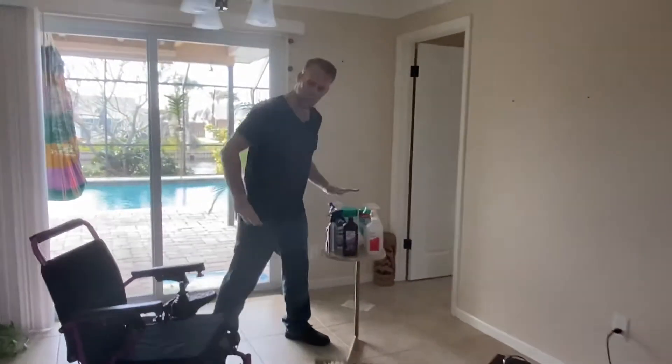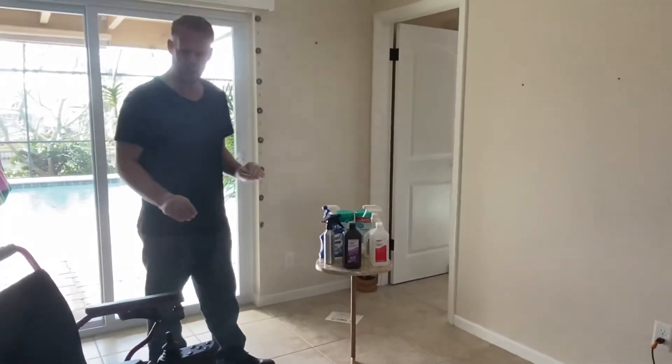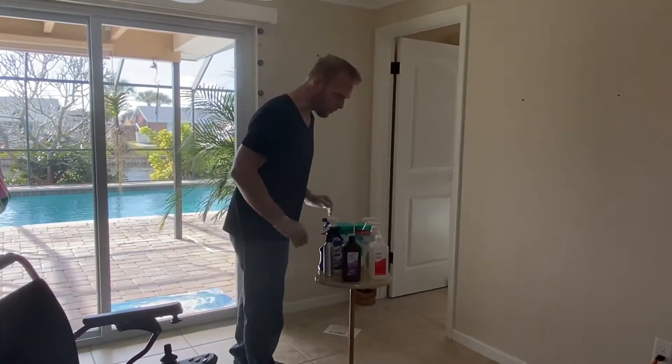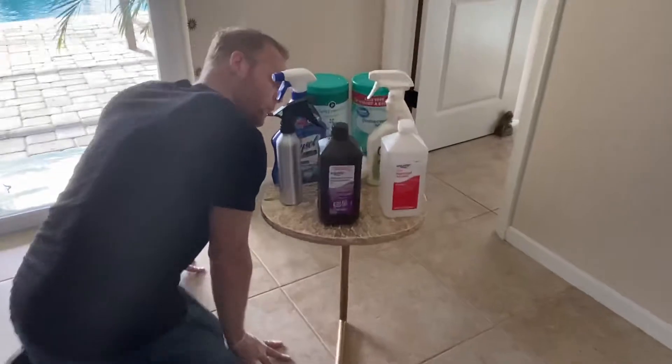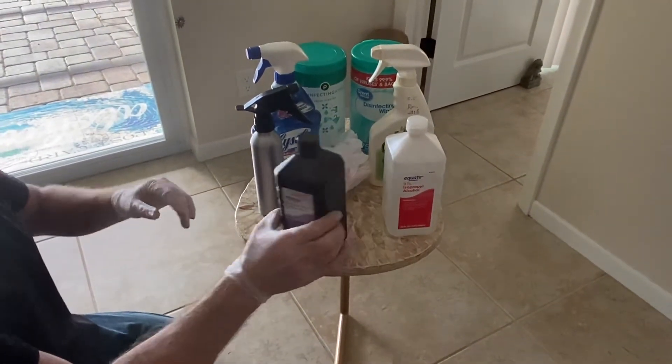Before we dive into the chair, we're going to take a look at the actual cleaning agents themselves. Coming over to our table, we'll look at some of the things that are good and some of the things that are not good.